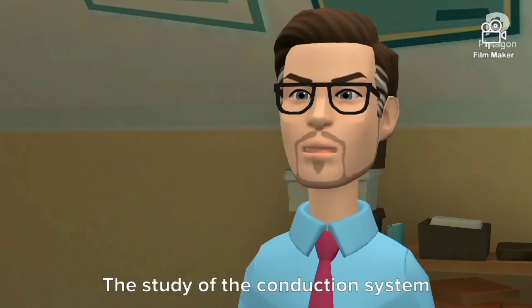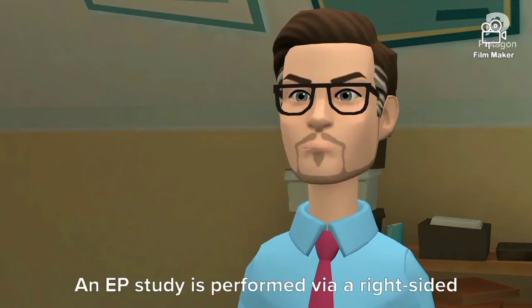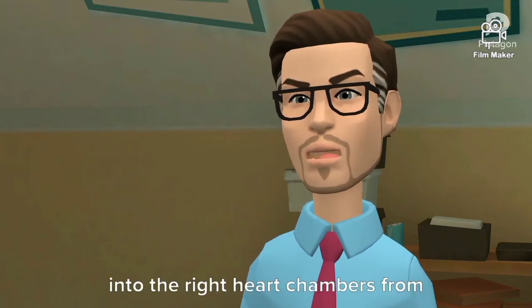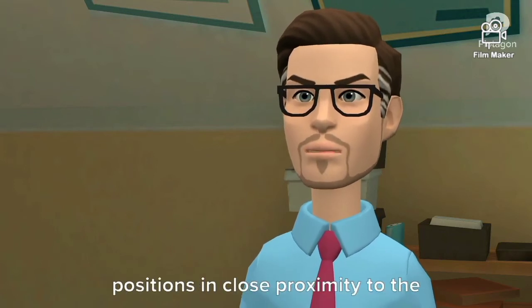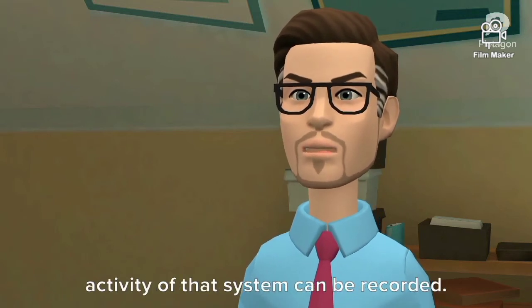Electrophysiology. The study of the conduction system of the heart is called cardiac electrophysiology, EP. An EP study is performed via a right-sided cardiac catheterization. A wire with an electrode at its tip is inserted into the right heart chambers from a peripheral vein and placed in various positions in close proximity to the conduction system so that the electrical activity of that system can be recorded.